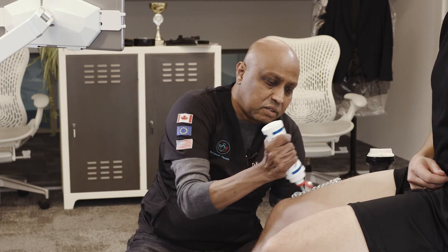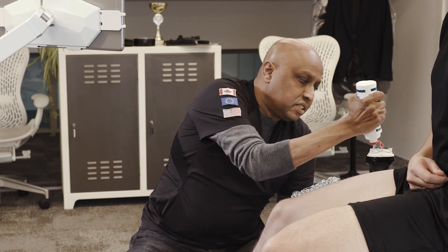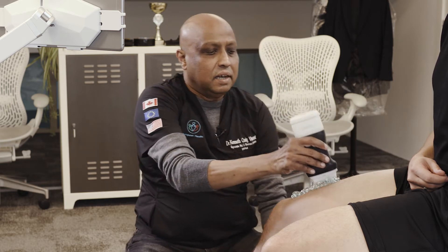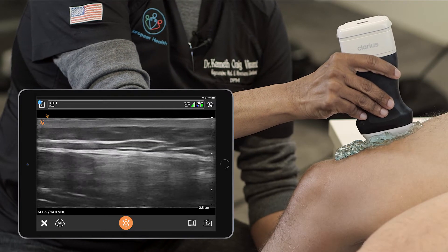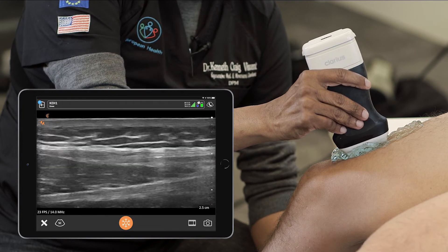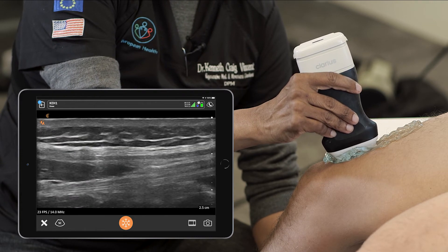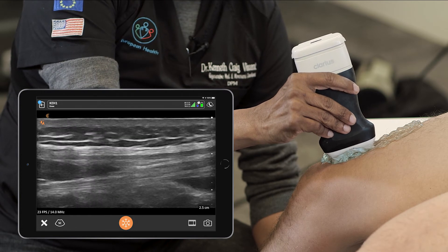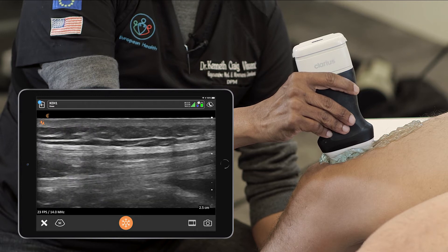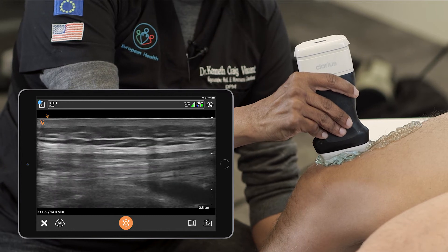I am going to concentrate on the anterior knee compartment and region, starting from the quadriceps. I'm going to start from medial to distal muscle belly coming down. We can start to see the contribution of the superficial layer of the rectus femoris, the deep layer of the vastae intermedia, and then the medial layers of the medial vastae and vastae lateralis.